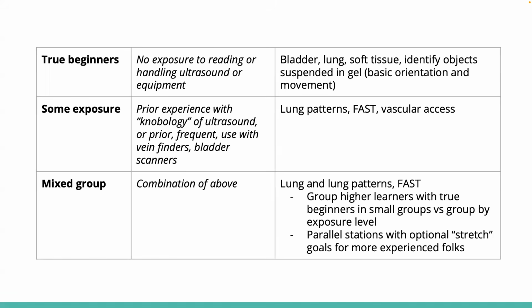So thinking of it in this way, for true beginners you maybe want to do bladder, basic lung, soft tissue, identifying objects suspended in gel, just to get the ultrasound basics of this is how you fan, this is how you slide, just to understand that orientation. And then translating it to one or two basic applications is probably going to get you the most bang for your buck, and people are going to be the most excited because they're getting those basics pretty quickly.